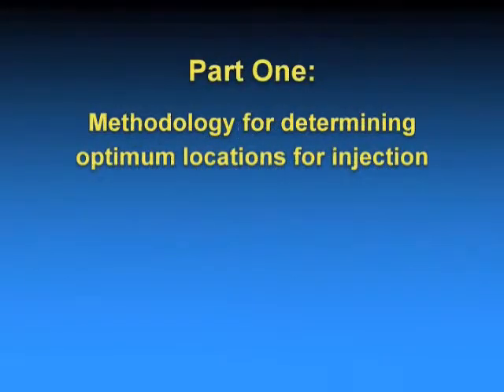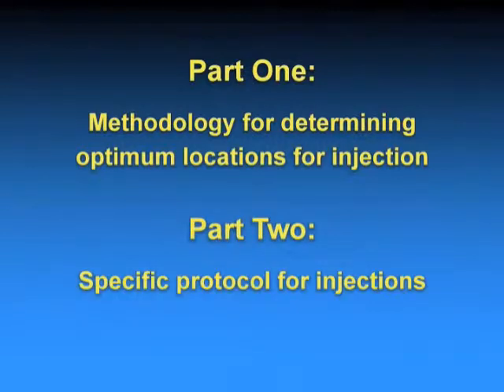The first part describes the methodology for evaluating patient information in order to determine the optimum location for injecting this cellular concentrate, and the second part presents a specific protocol for performing the actual injections.